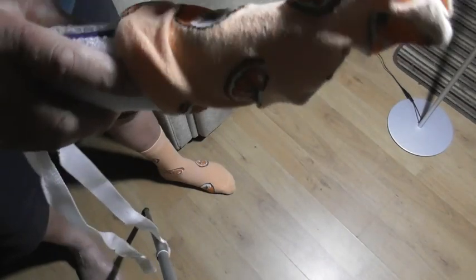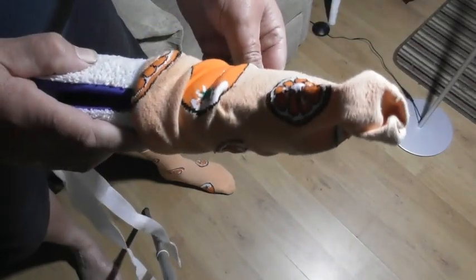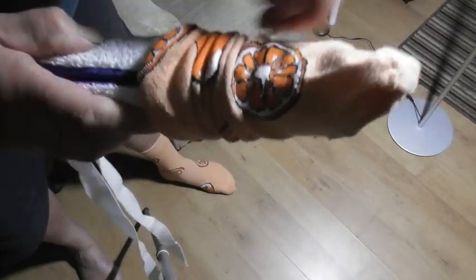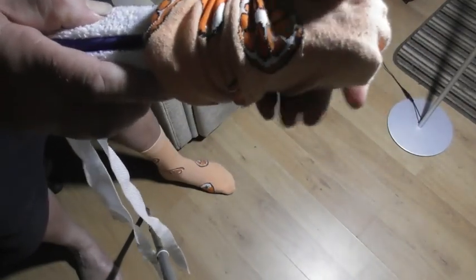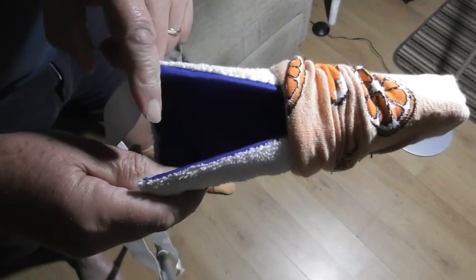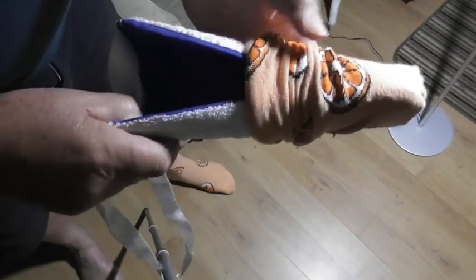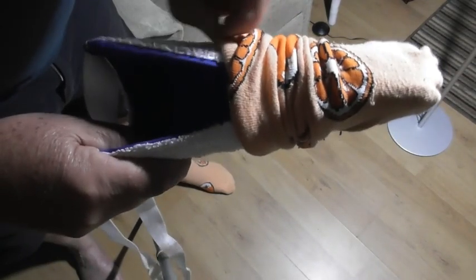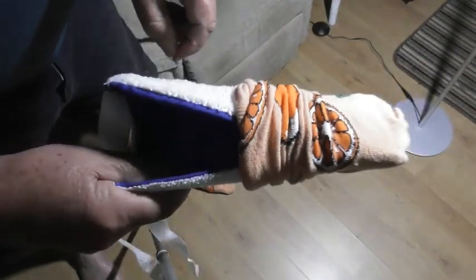Pull that on. What I do is pull it right up until the foot is completely onto the bottom of the sock aid. I found it's best not to bring the sock too far up here, otherwise you'll find it quite difficult to get it onto your foot. You'll just have to try by trial and error to see how this works best for you.